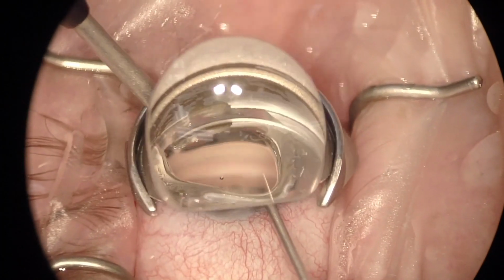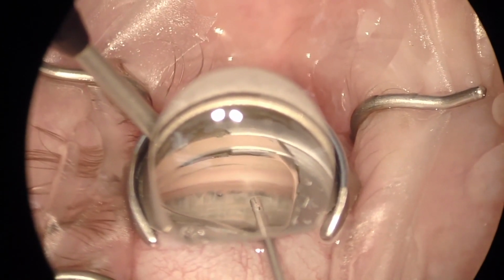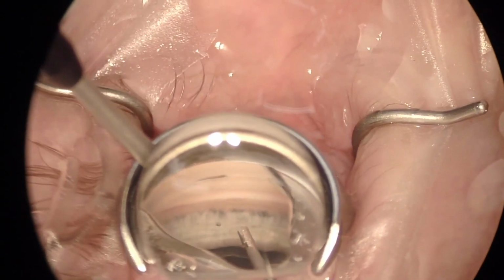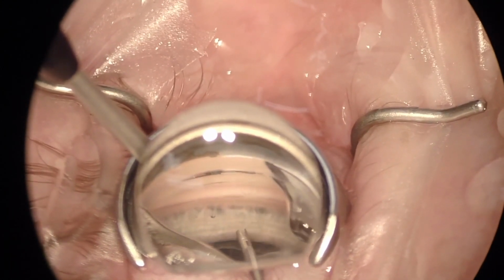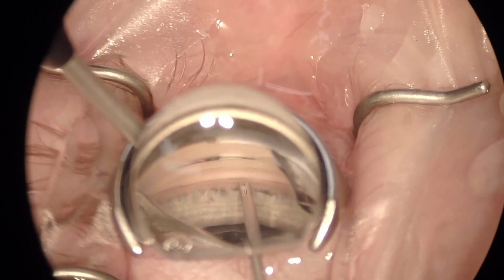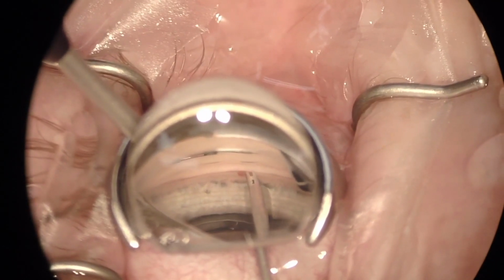So here's a real life case, again showing some trocar bias. And so again, you get everything in good focus, wiggle in your incision, and pull back on the protective sleeve to expose the trocars. And what I'll show here, what you don't get in the wet lab, is that when you poke around in the trabecular meshwork, you do get some reflex bleeding. And so again, I'm just getting ready to get everything in the right position, and I'll puncture the trabecular meshwork with my trocar. And you can see, again, how much bias you can put on that trocar, and immediately there's a little bit of blood reflux.